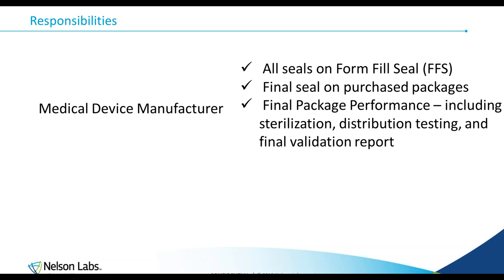And then, what is your responsibility? You're responsible for all seals on a form fill seal. You're responsible for the seals you make in-house on a pouch or a tray. And then, just as important, you're responsible for all package performance testing, including sterilization, distribution, and the final validation report.